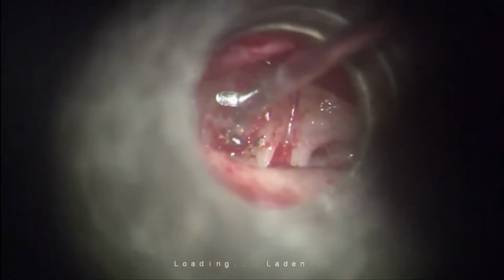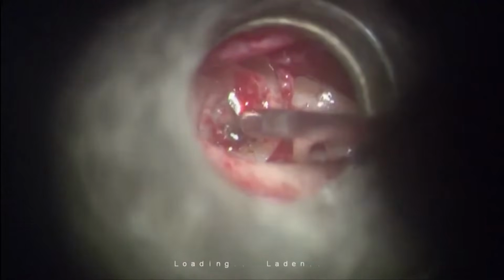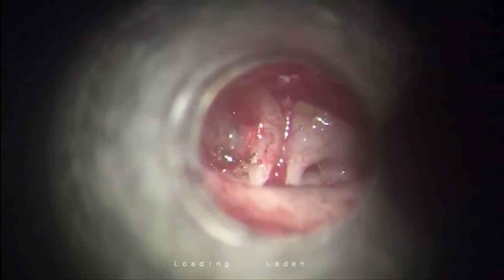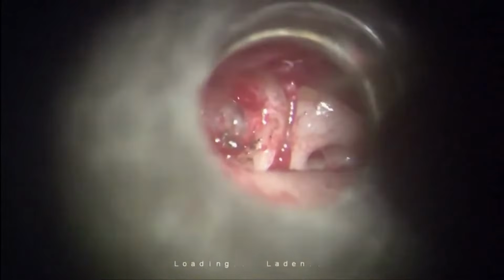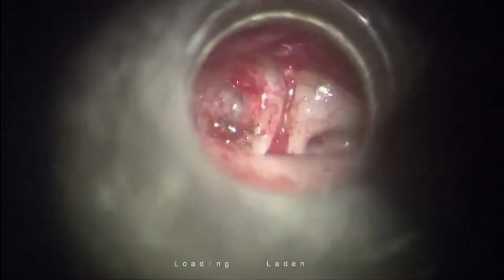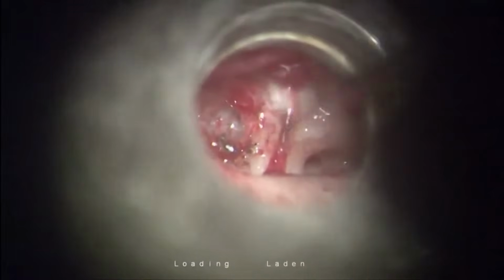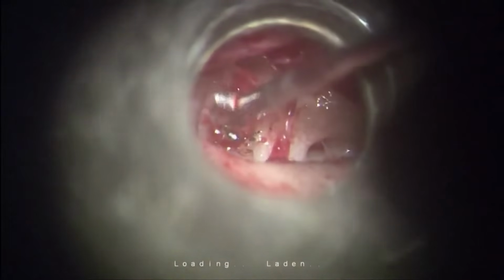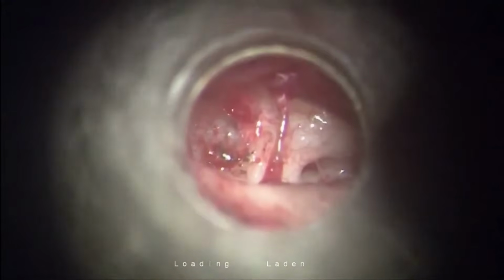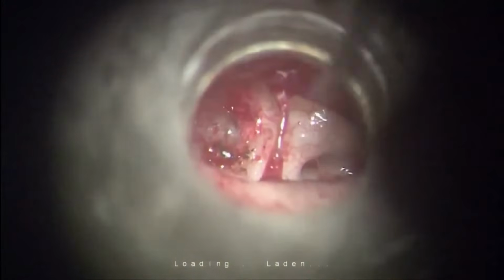I will place this. It should coincide with the incus. Can you see? Yes, sir. I will repeat it. Today people enjoyed the Teflon piston also. Now, 4.5, and then it is just a little long, so I will change to 4.25. Now see, it should coincide with the incus. Now it is perfect. Can you see? Yes, sir. So my piston is 4.25.